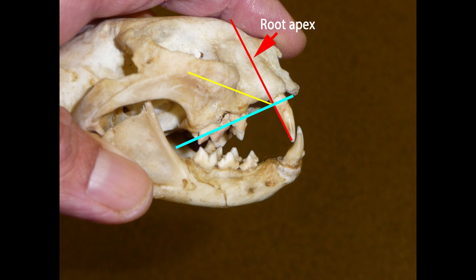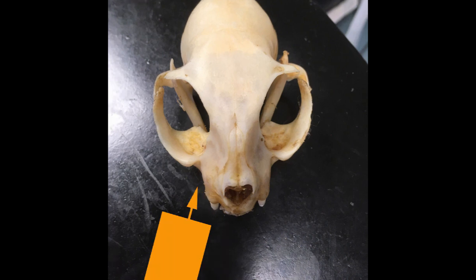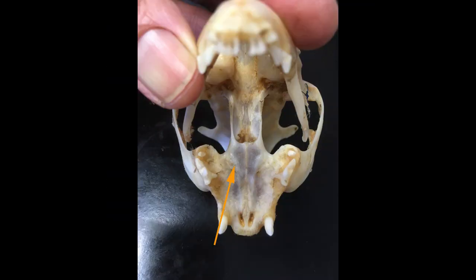So there's the red line from the tip of the canine to the roots. The blue line is your plate. We are then putting our head along the red line, swinging it round halfway between the angle onto the yellow line. When I say then move it up 15 degrees, what I actually mean is swing the axis out by 15 degrees from the midline. So rather than coming straight down the midline as thus, we then swing it out, separating the roots of the canine from the bonier parts of the skull.